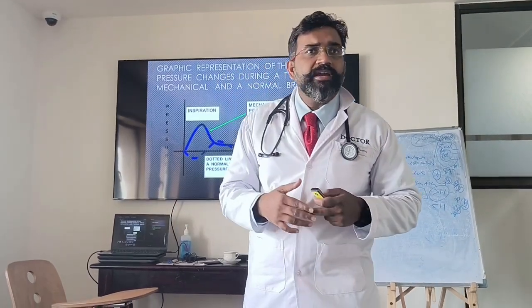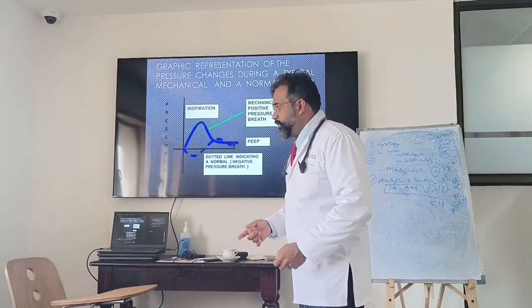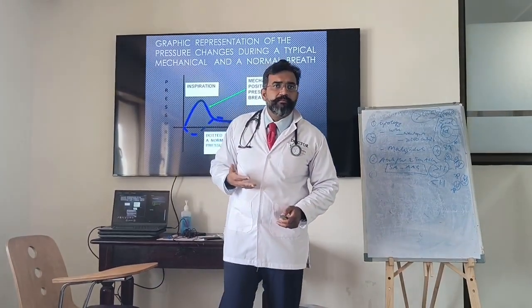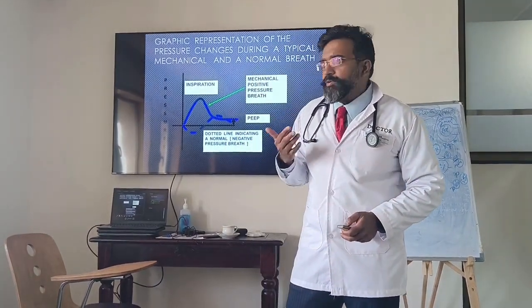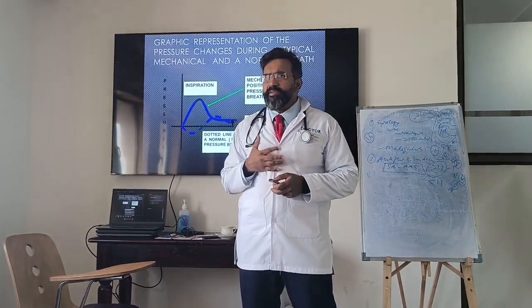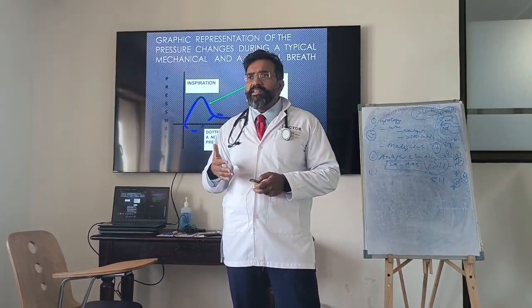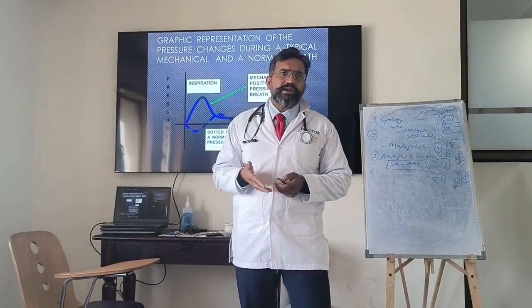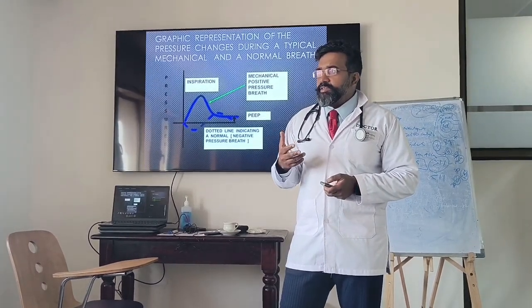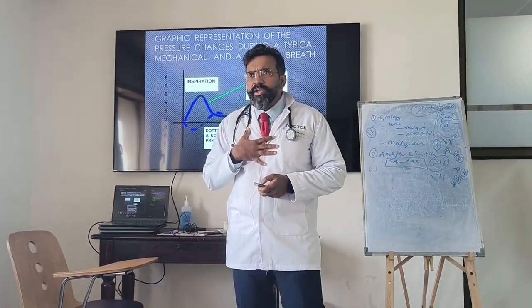But in a mechanically ventilated patient, it is the absolute opposite. You start with positive pressure, and remain positive. You don't go to negative pressure unless the patient takes a breath. You understand? You remain positive all the time. That's the reason this can be extremely harmful, difficult and discomforting for anyone. You are thinking of breathing in and the ventilator is actually pushing air in. You are trying to breathe, but they are not allowing you to breathe out properly. It is discomforting.